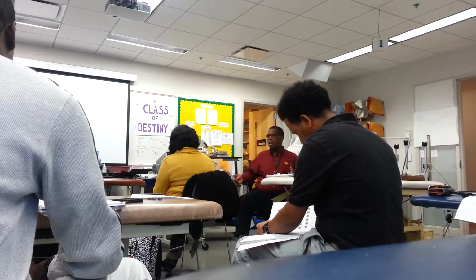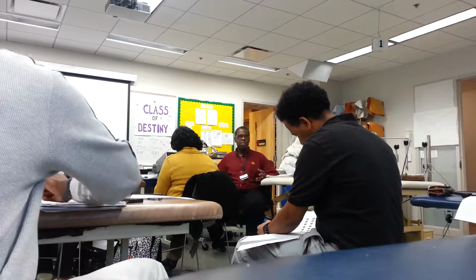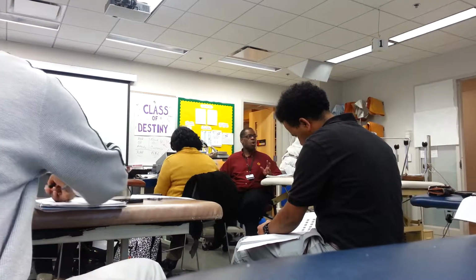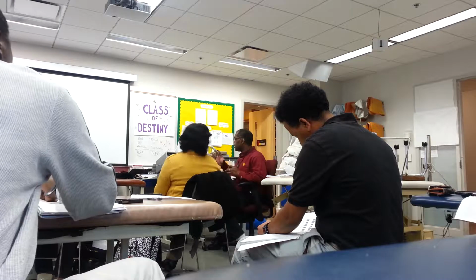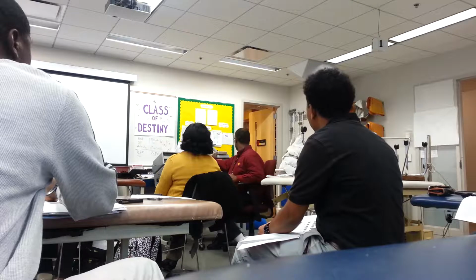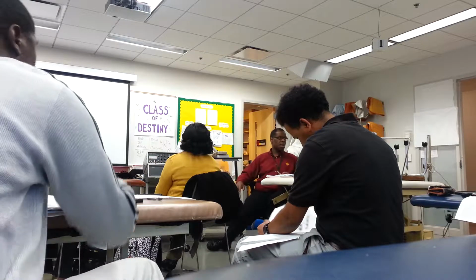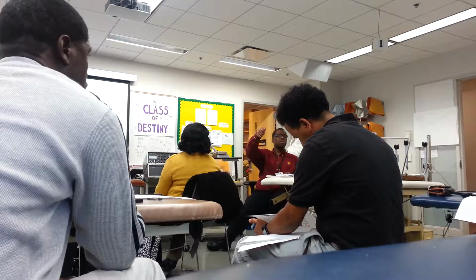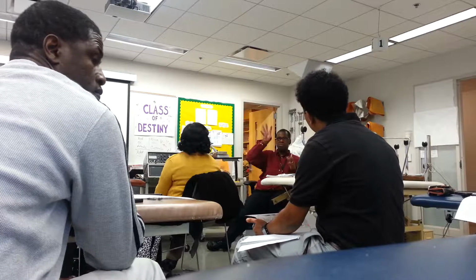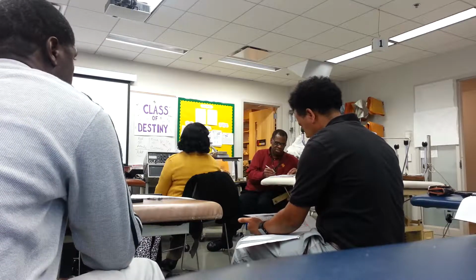So again, I wanted a monophasic machine because a monophasic machine has a polarity switch. When I go to pick a machine, I need to pick one where I can see the word polarity on it. It's this one, and there's another one back there that has polarity on it. I think that other one has a knob you can turn to the left or to the right to the positive and negative polarity. So that's what I want to grab. I'm looking for the polarity switch, page 26.